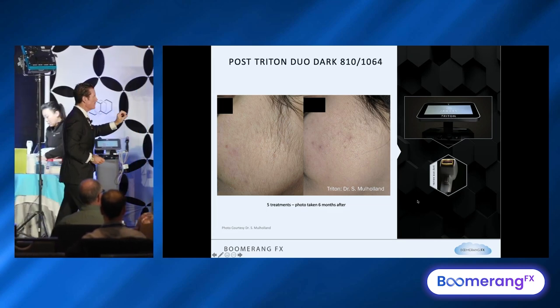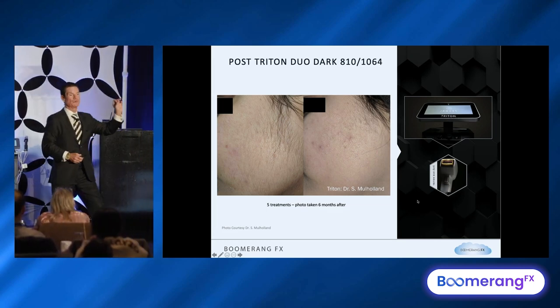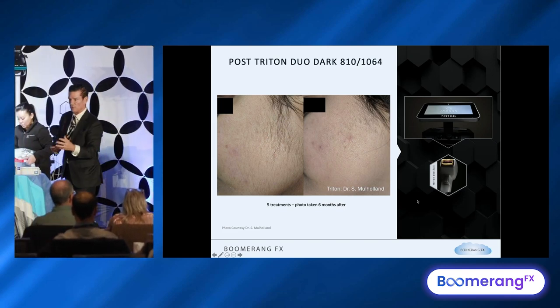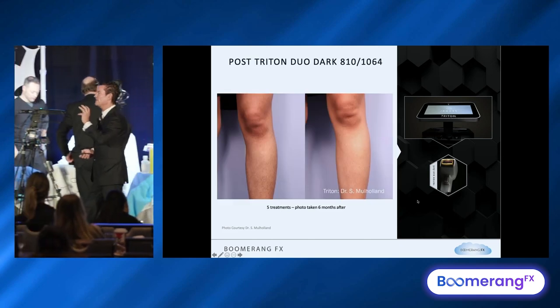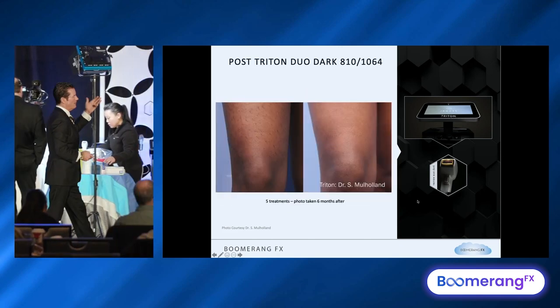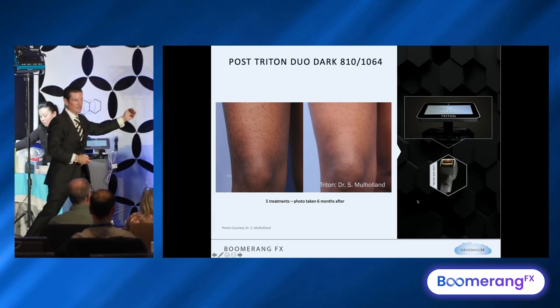In my practice I'd be cautious and use the Duo Dark for this type of skin. She may come back and not have much pigment response, and I might do dual light then, but I would start with Duo Dark — definitely for this skin type. And once they're Caribbean or African-American, that would definitely be a Duo Dark.